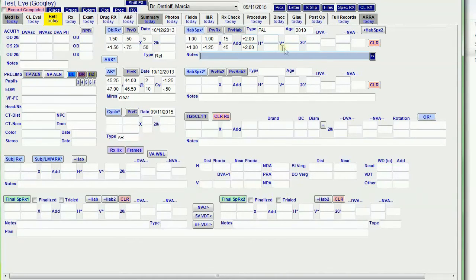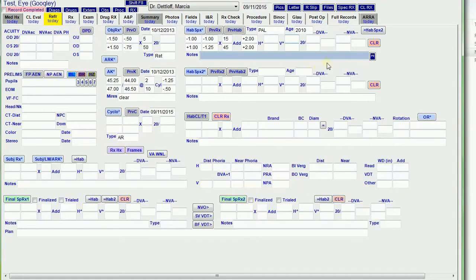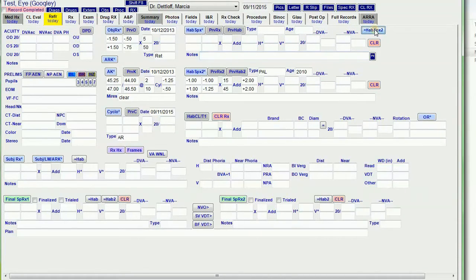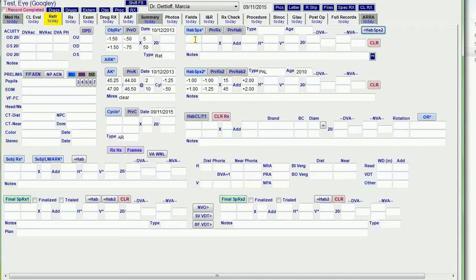I like this to be used for their general purpose pair, and if they have special near vision only or computer glasses, I prefer that to be in habitual two. So if they get switched around, I can hit this button, and that puts that data into habitual two, and then they can redo the correct one here.